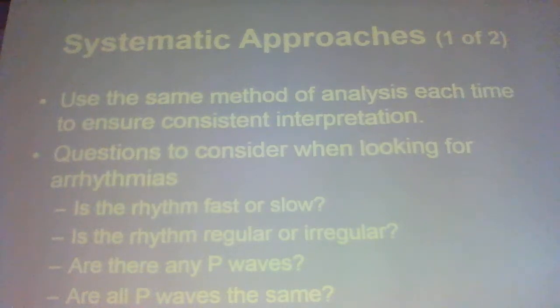All right. Then we're going to go down leads 1, 2, 3, AVR, AVL, AVF, V1, 2, 3, V4, 5, 6. We're going to look at the J point.